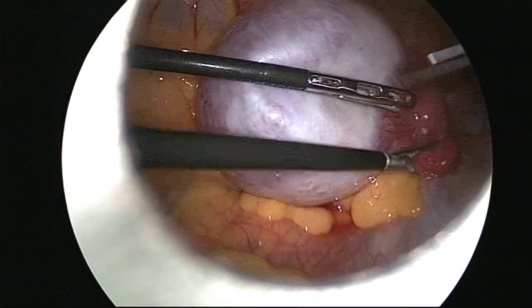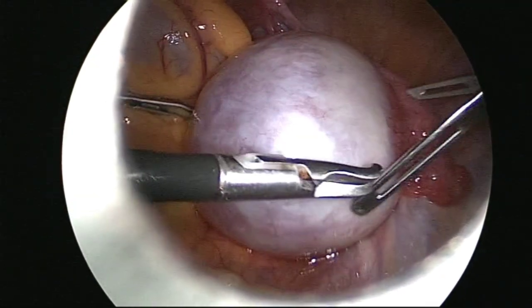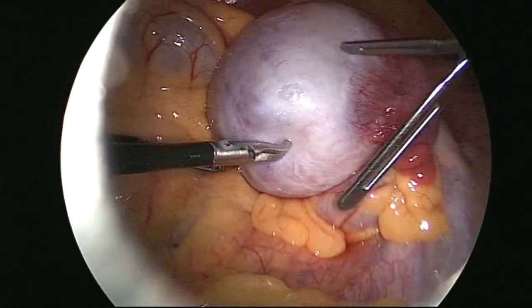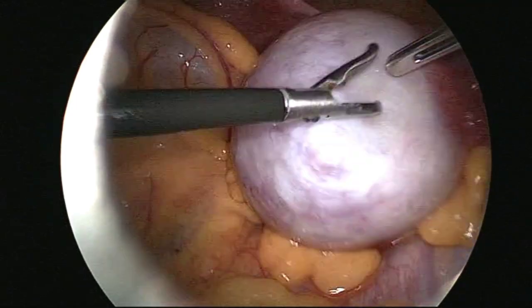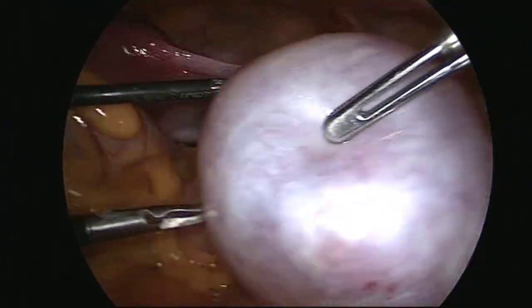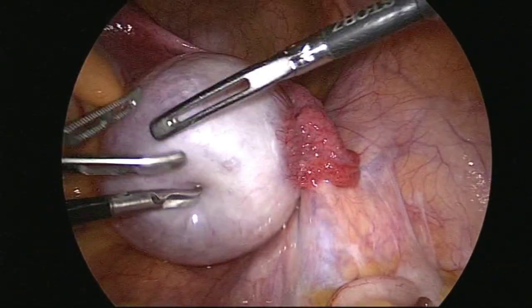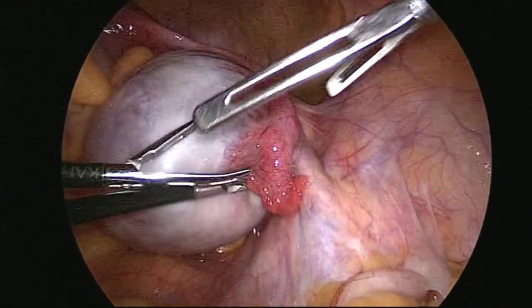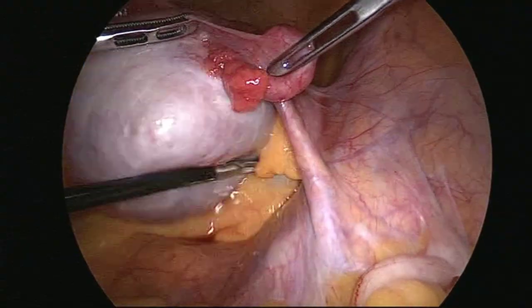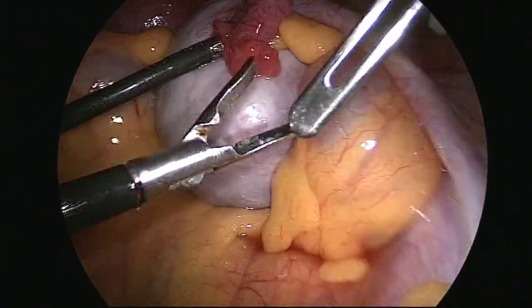Now I am able to see that all the ovary is involved. I want to see if there is any other healthy ovarian tissue behind the cyst or not. My plan is to remove the cyst en toto. I want to enucleate the cyst first, and then I will remove or aspirate that.